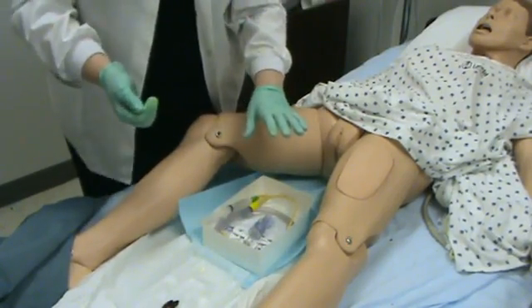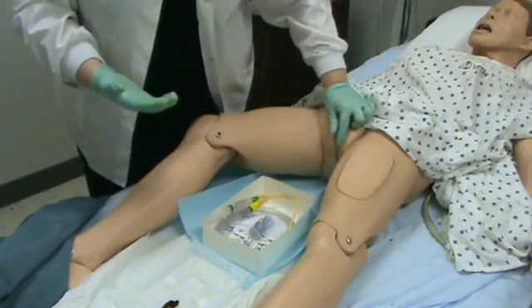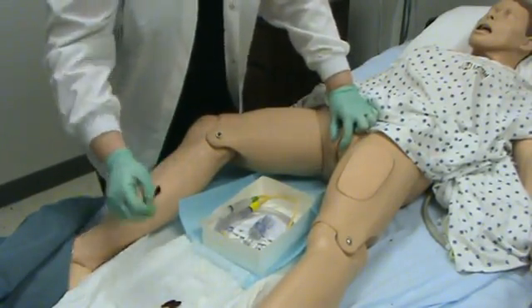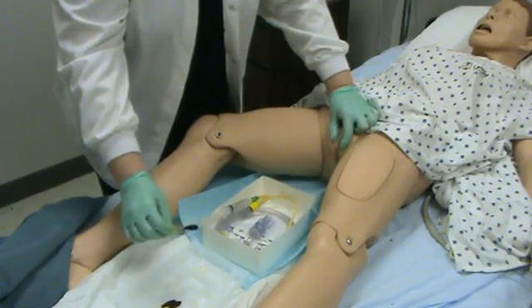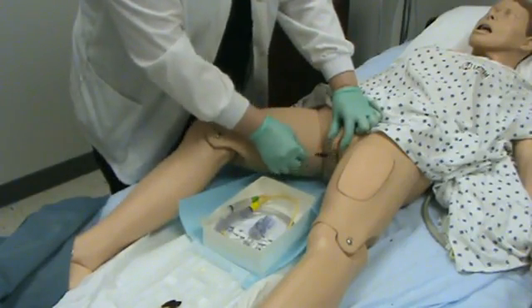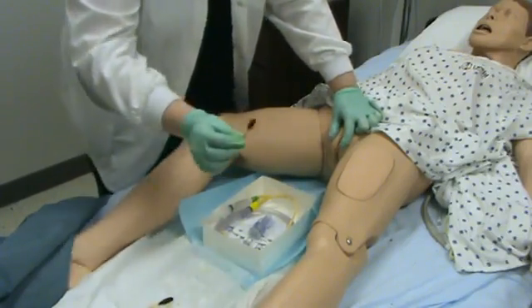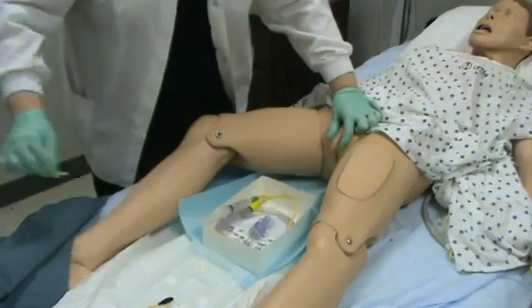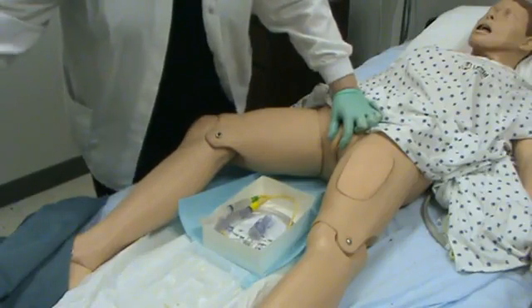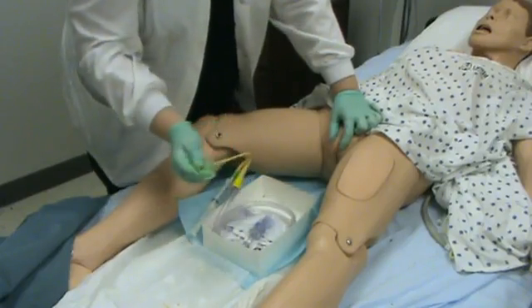I am now going to contaminate my left hand. I am going to pull and separate the labia so that I can get a good visual of the urinary meatus. With the cotton tip applicators, or there may be cotton balls that you would be using with a tweezer, I am going to come over my sterile field, go down one side, come along to the side — do not cross your sterile field. Take my next one, go down the other side, come around my sterile field, one more down the center, always maintaining the labia separated so as not to contaminate.